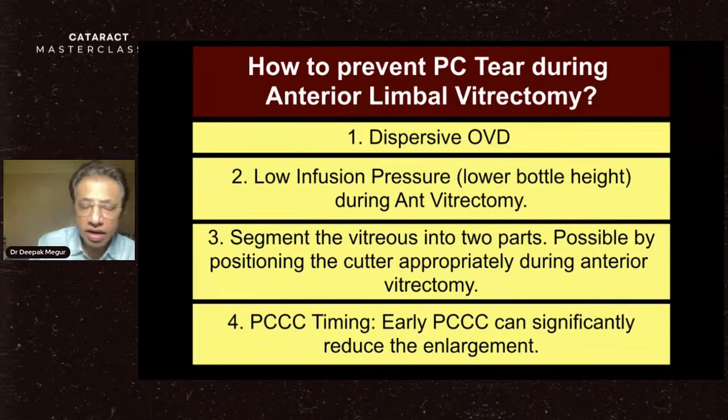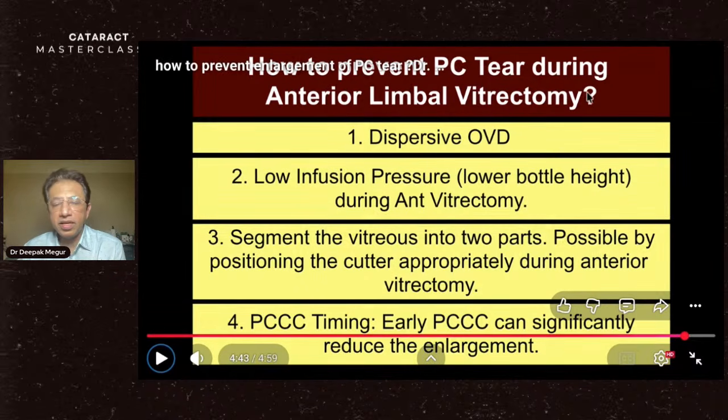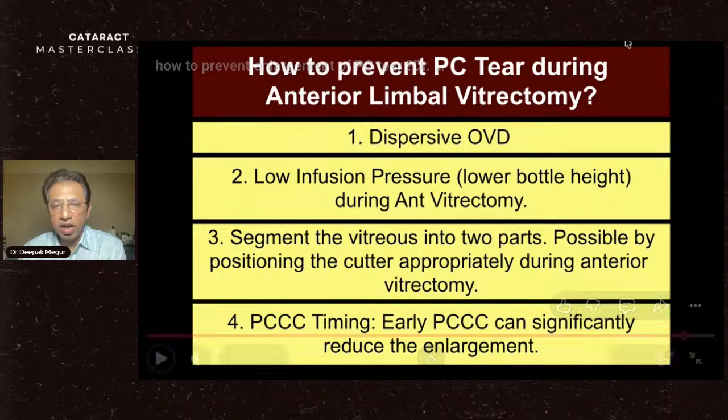Timing is critical. It's always better to do it before doing vitrectomy if possible. It's not always possible, because it is easier to do it when there is vitreous supporting it posteriorly; when the eye becomes very soft, it becomes a little bit challenging to perform the PCCC. I think with that message, I'd just like to conclude my presentation. Thank you so much.